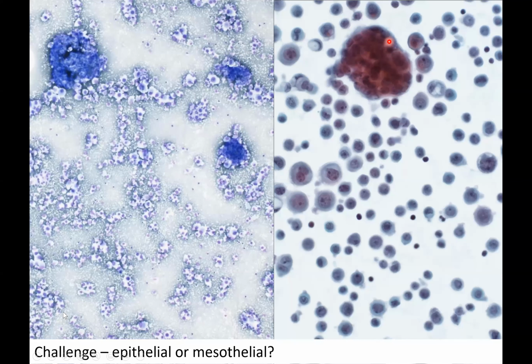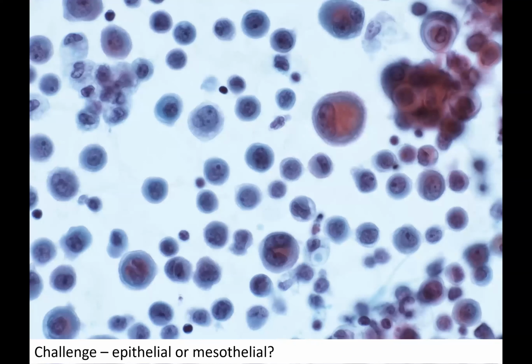Here's another case. This time there are a few clusters, but also many single cells in the background. At higher power, some of the clusters seem to lack a community border, and the single cells have a frilly border, some reddish cytoplasm, eccentrically placed nuclei. From assessment of the nuclei, we can see how irregular they are, and the cells are obviously malignant.